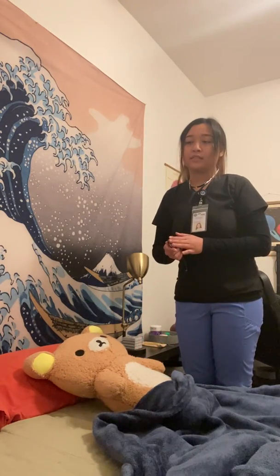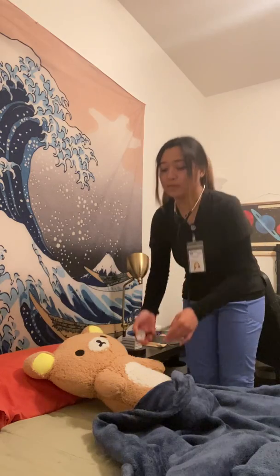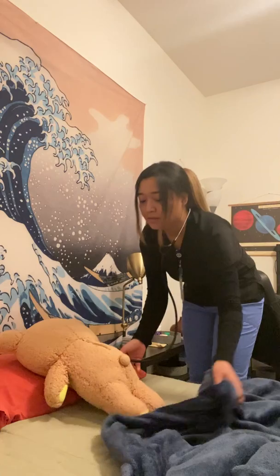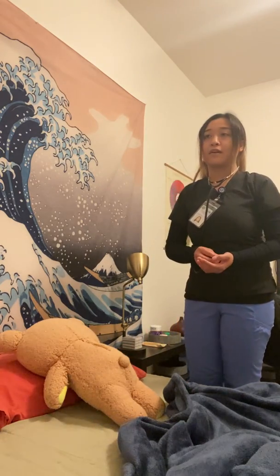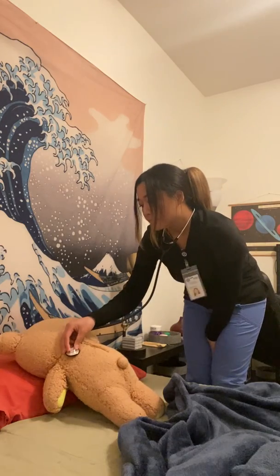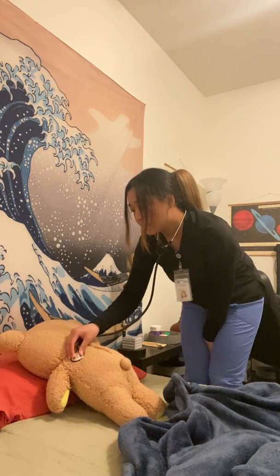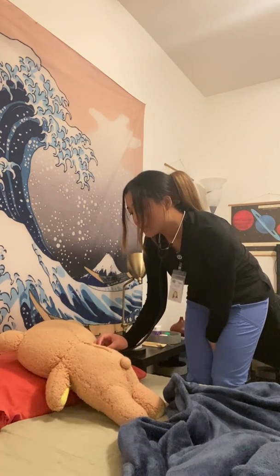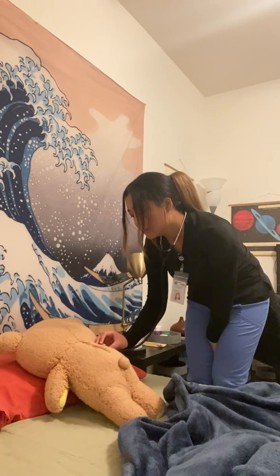So I'm gonna go listen to her back and do the same thing, but just on her back. She could sit up, but she'll be laying down like this. So again, I'm gonna be listening for any wheezing or crackles. And take a deep breath in. I'll make sure that I'm not going over the scapula because I won't be able to hear through the bone.